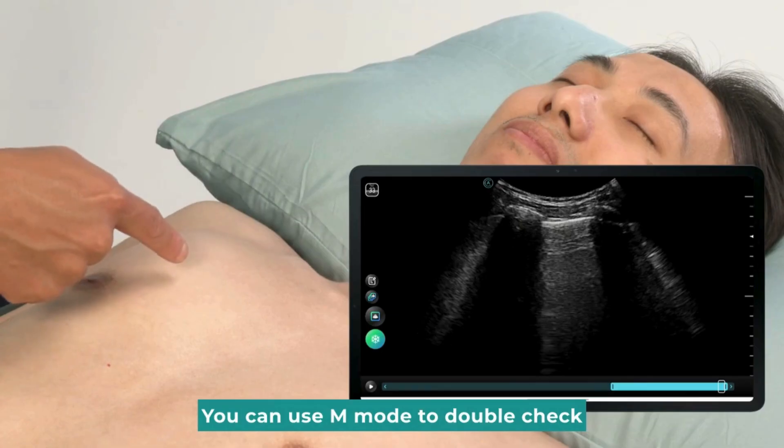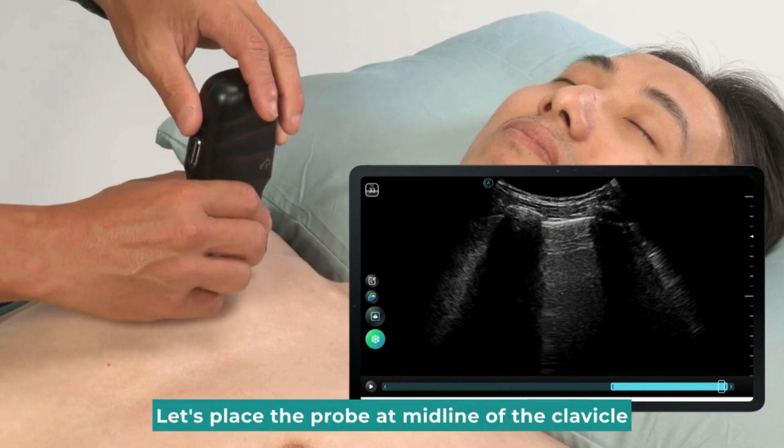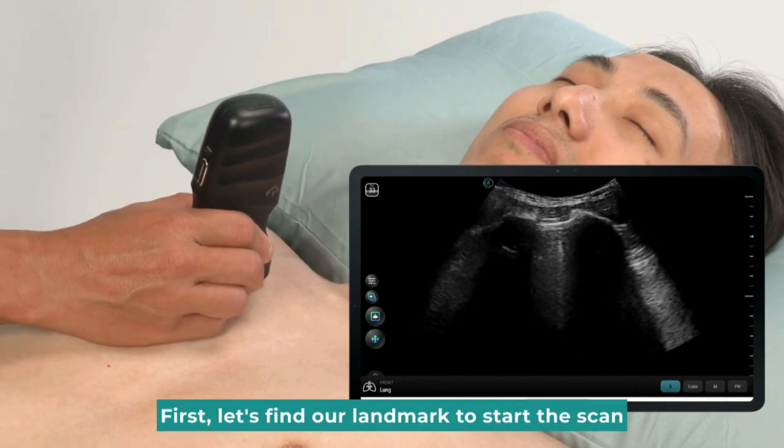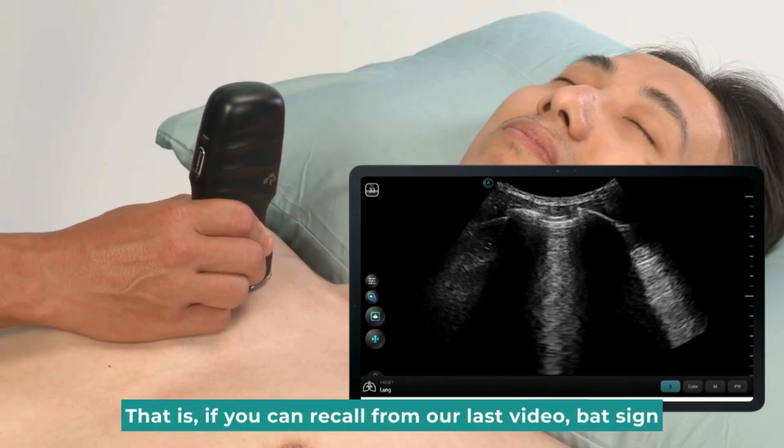You can use M-Mode to double-check. Let's place the probe at the midline of the clavicle, perpendicular to the chest. First, let's find our landmark to start the scan. That is, if you can recall from our last video, the Bat sign.